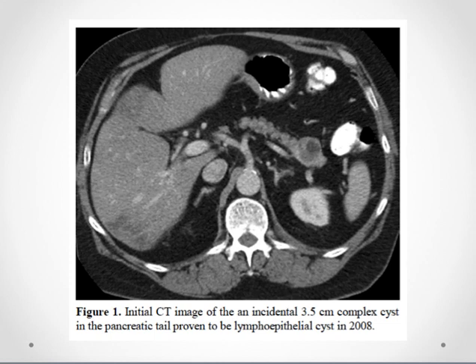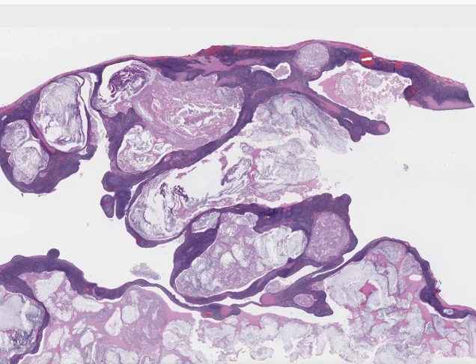Now there would be a couple of ways to approach this. One would be by means of endoscopic ultrasound and needle aspiration, which would yield diagnostic material, as well as, in complicated situations, surgical resection. Since this is a discussion of surgical pathology, we're going to go to the surgical specimen rather than focus on the cytologic findings, which also can be quite characteristic in this particular entity.